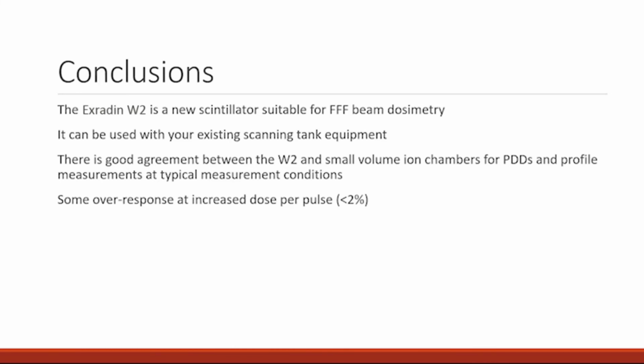Yeah. There's a question from the audience. Did you notice any CLR fluctuations between the dose rates, or did you check the CLR at the different dose rates? We did not check the CLR at the different dose rates.